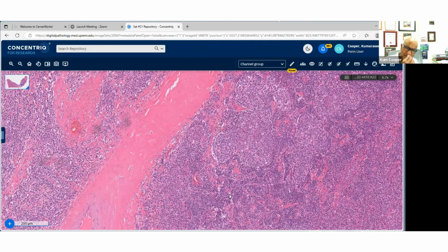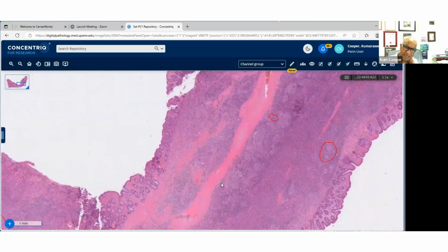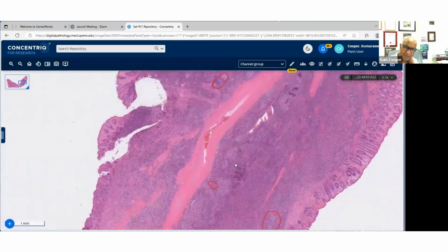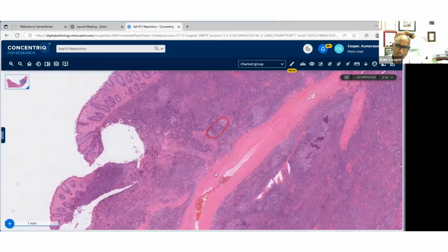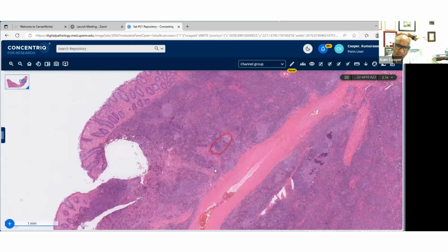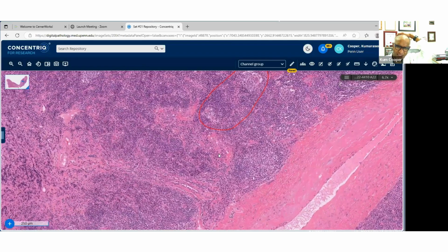So just be aware of that. If you see something like this involving a mucosal site in the aerodigestive tract, think of that and do an Epstein-Barr virus. And if it highlights these large cells, then do the CD21, 35, 23, because that will help you identify follicular dendritic cells.